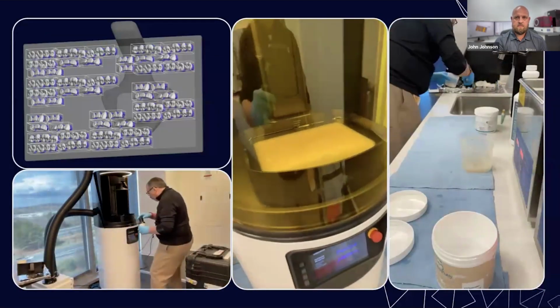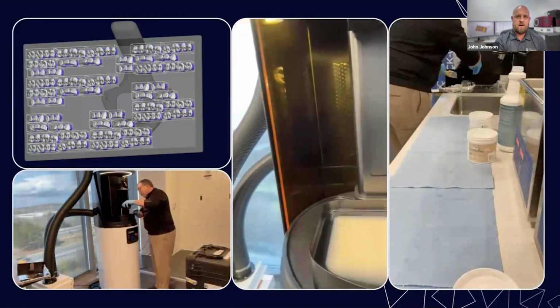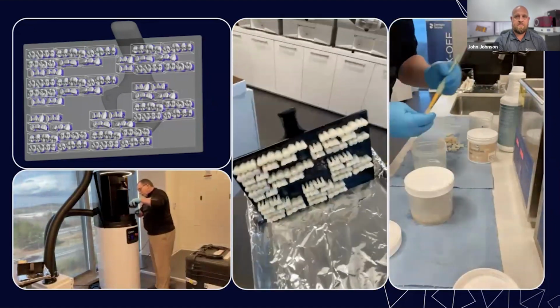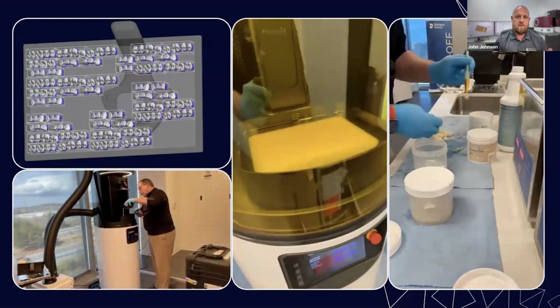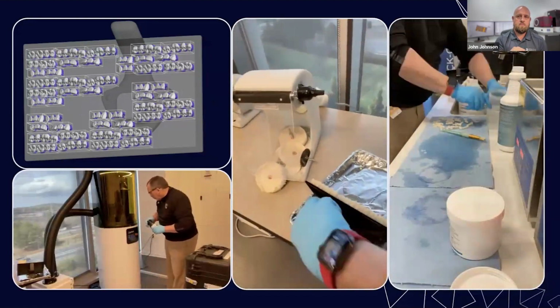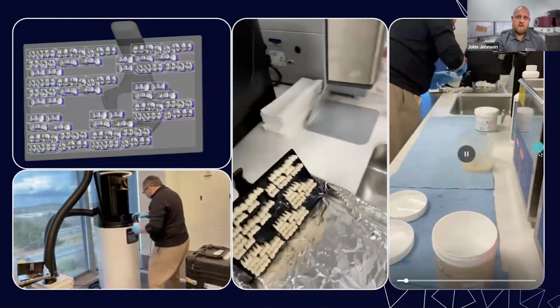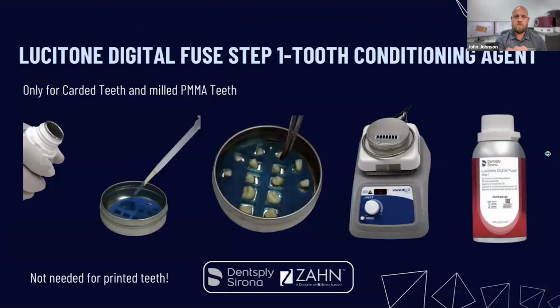This is a great video. I'd love to produce another video of these, but Jimmy Stiegel did such a great job producing this, there's just no reason to. This is him printing denture teeth, and the video to the far right is him actually going through that cleaning process. So I use a 2-in-2 method. It's 2 minutes in one bucket, with a toothbrush washing with the alcohol itself, and that can be a dirty wash. Then you're going to go back into a new clean wash with the isopropyl alcohol for another 2 minutes, and then another brush. Then you're done from there. I like to let my material set for a little while to get that residual alcohol free, and then you're ready to start fusing.